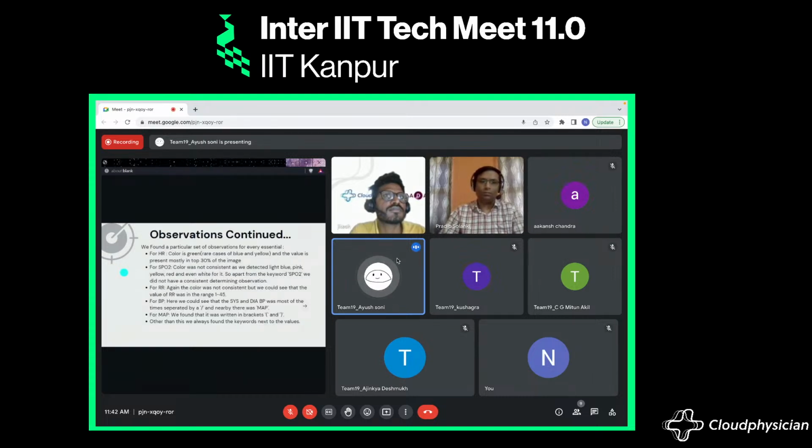Some more particulars that we observed. HR is mostly in the color green and present on top of the images. SpO2 and RR didn't show any color consistency, but were close to the keywords associated with them, and RR was in the range 1 to 45. BP was always displayed with a slash in between SBP and DBP, and MAP was always found in brackets. These also followed the keyword trend.